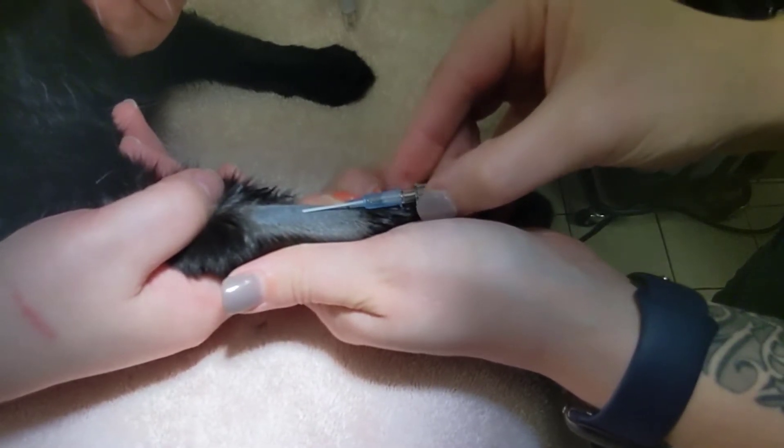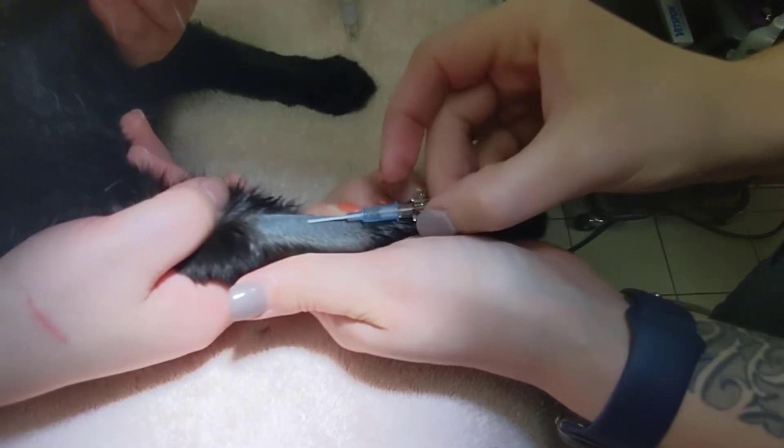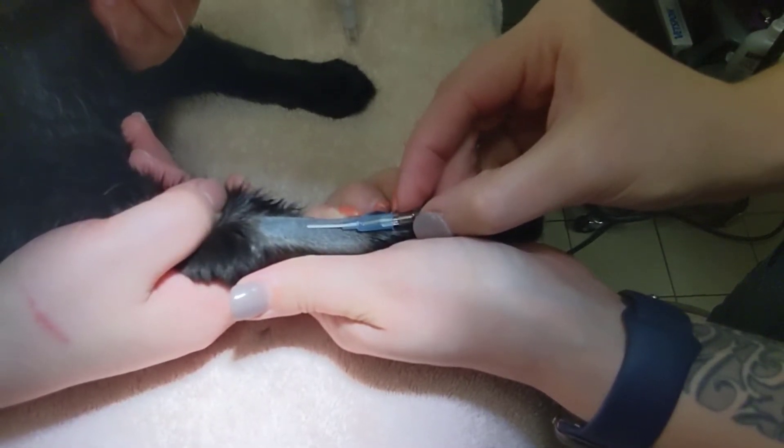In this demonstration, the technician placed the catheter in the vein, blood flashed into the chamber, but the technician was unable to push the catheter all the way into the vein.